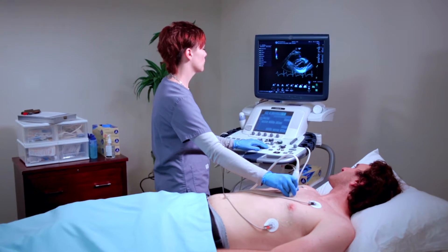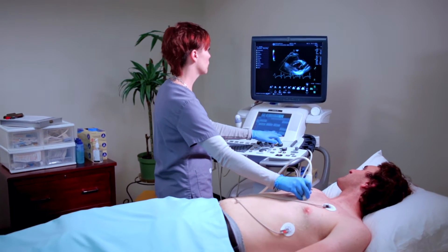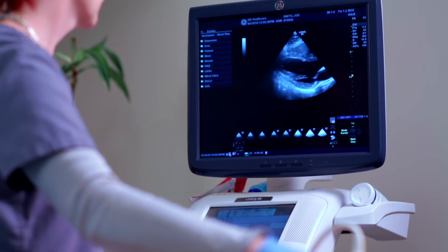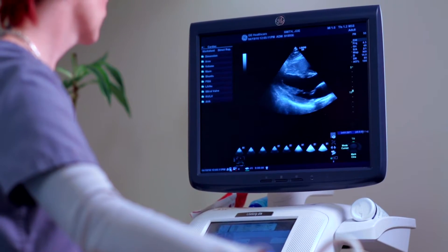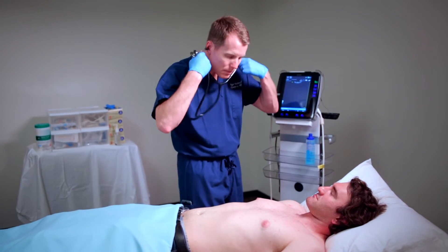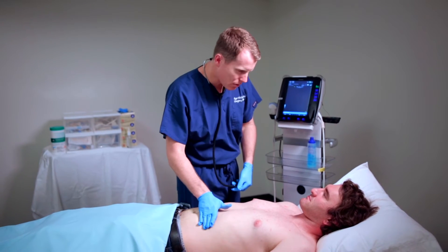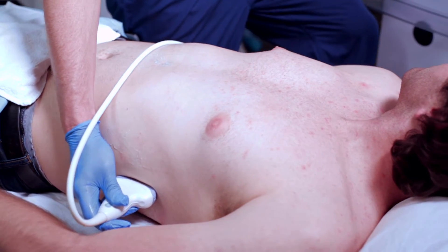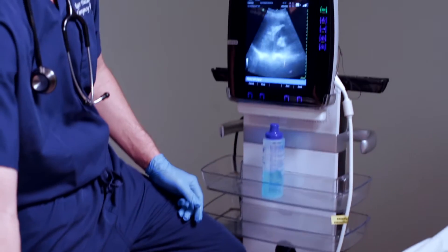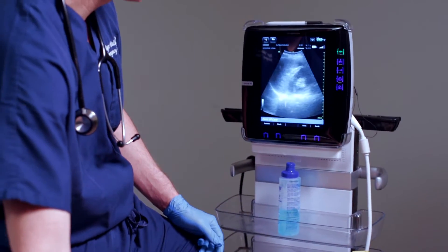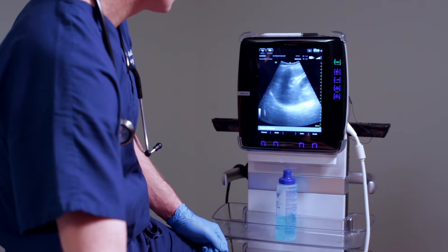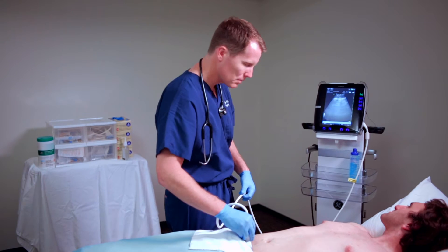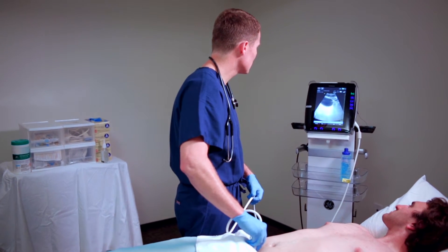Ultrasound technology has revolutionized the way clinical medicine is practiced by allowing care providers to see inside a patient's body in real time. Clinicians no longer have to rely solely on their five senses when performing a physical examination. Ultrasound enables a clinician to thoroughly examine, assess, and evaluate a patient's condition faster and more accurately. As a result, the use of clinician-operated bedside ultrasound reflects state-of-the-art medical care.